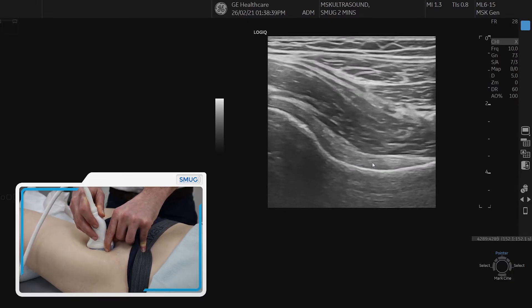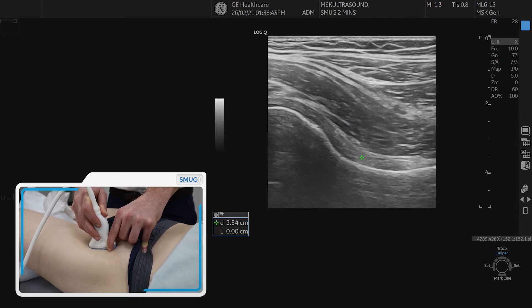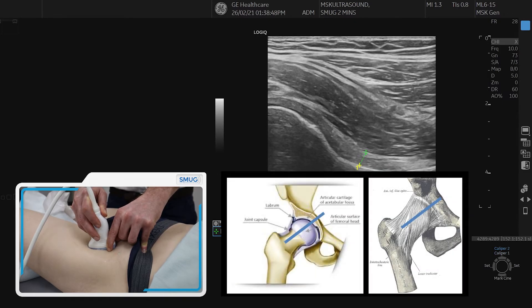If we slide down, this is where we carry out hip intraarticular injections. And it's important to measure the anterior capsule, which is the iliofemoral ligament.